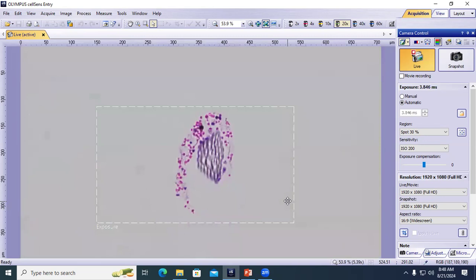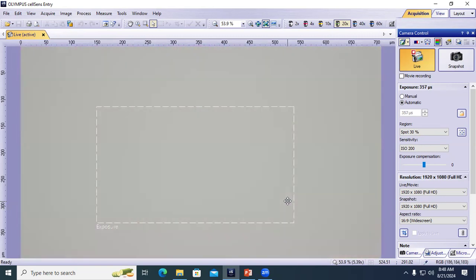Thorn from a tree, like a hawthorn, maybe. Okay. Dr. D votes for a thorn. Dr. D is our plant pathologist. Not a pine needle. Yeah, no, that doesn't look like a cactus one. Okay. Anyway, so a particularly large example of a grass awn, or maybe a thorn of some sort. So I could sleep better that night after I thought, oh my gosh, did I just misdiagnose this thing? So okay, now Leandro has a few minutes.